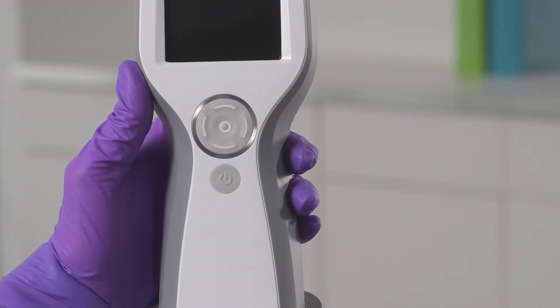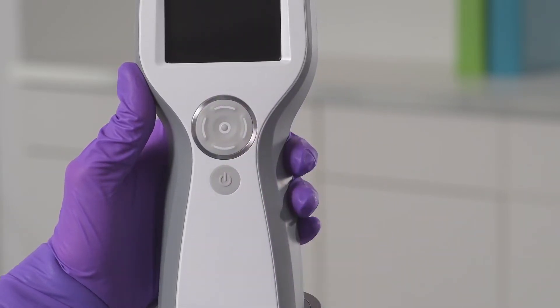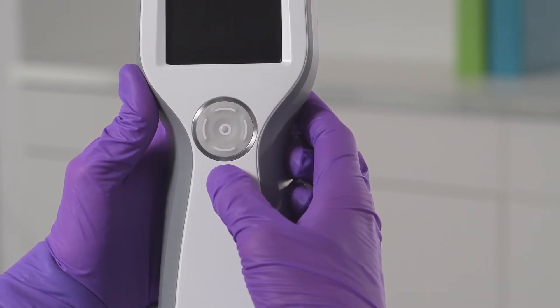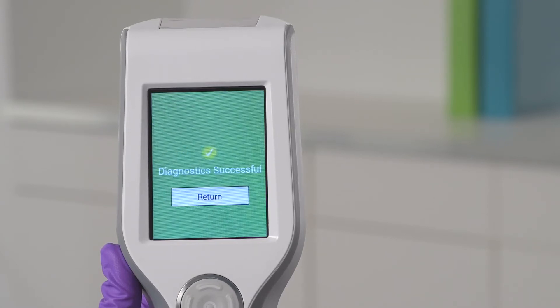First, we need to make sure the luminometer is powered on. Press the up button on the luminometer to wake it up if it has gone into sleep mode. If it doesn't wake up, the device has likely powered off. Press and hold the power button for three seconds to power on. As it powers up, the luminometer loads by running a device diagnostic. When the diagnostic is complete, tap Return.